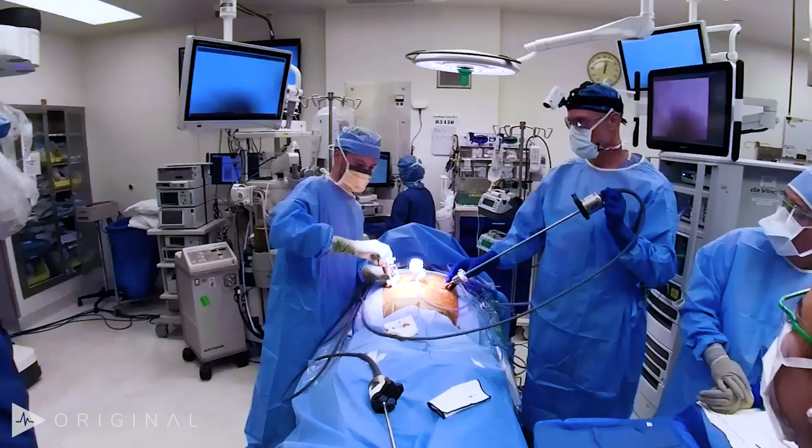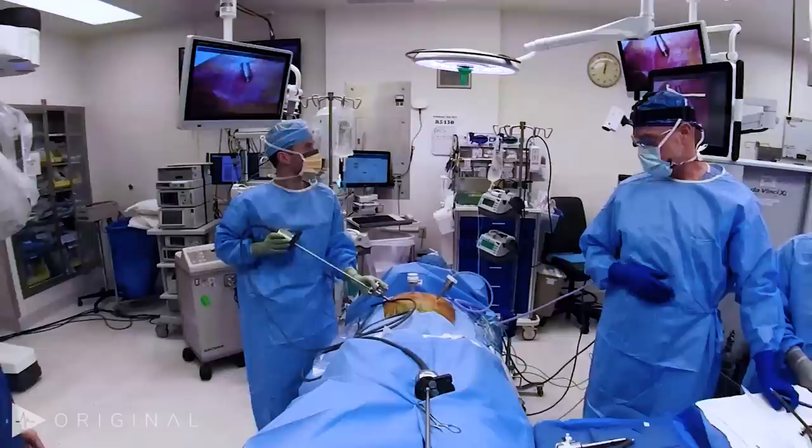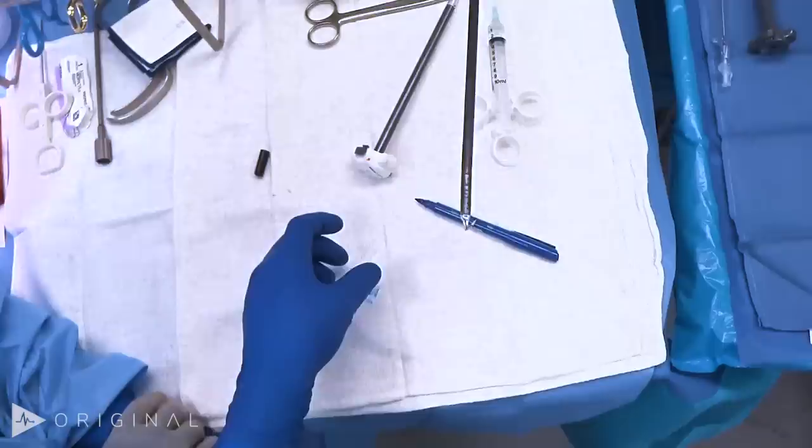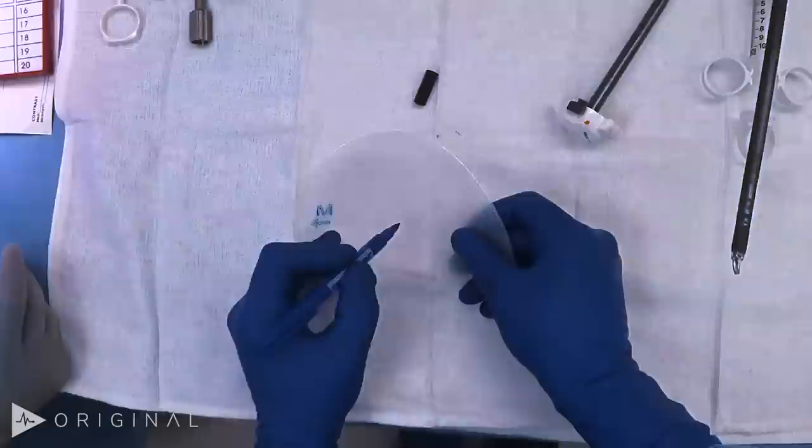This operation is done in steep Trendelenburg, arms tucked, patient supine. We go really steep Trendelenburg and have placed a shoulder harness above the shoulders so the patient can't slide. We're using a Bard 3D Max mesh — it's a contoured mesh, and you can see the center of concavity where the internal ring should go.